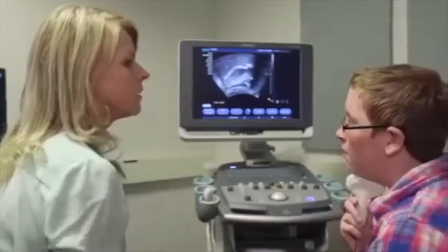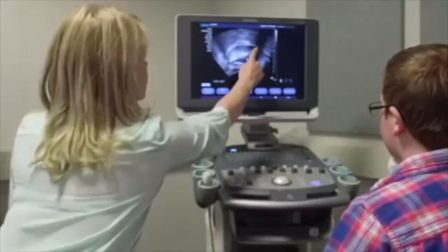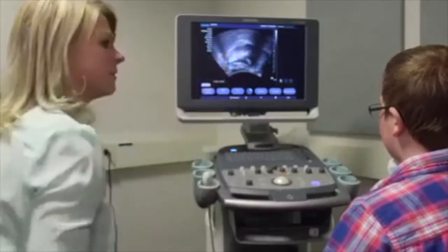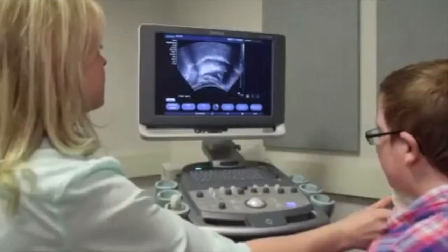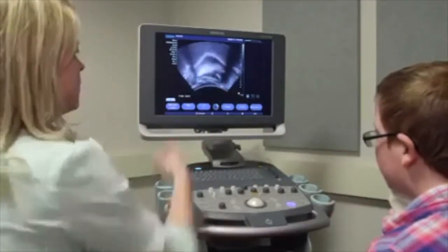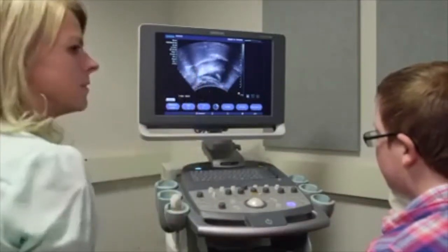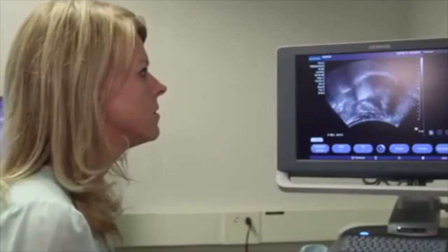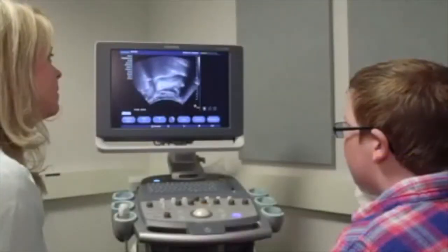Instruct the participant to produce alveolar and velar sounds such as T, D, N, then K, and G to help orient both the participant and the clinician to which side of the image is anterior tongue tip and which side is posterior tongue dorsum. In a sagittal view of a correct production of R, check to see that the anterior portion of the tongue elevates while the back part of the tongue dorsum slopes backwards.